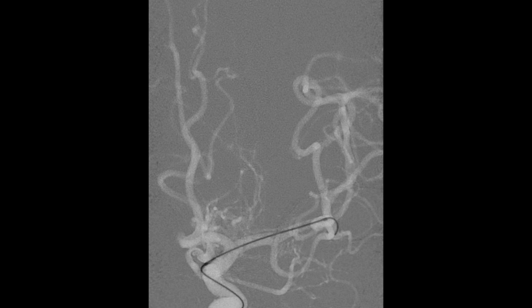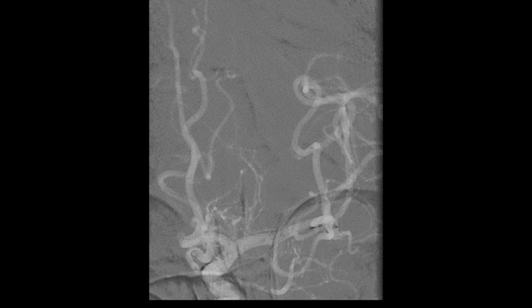Occasionally, if the device folds too much during the procedure, it might not fully open even after we rotate it back. In this 90-degree MCA aneurysm, as we advance, observe how the proximal segment collapses while the distal end fully expands.